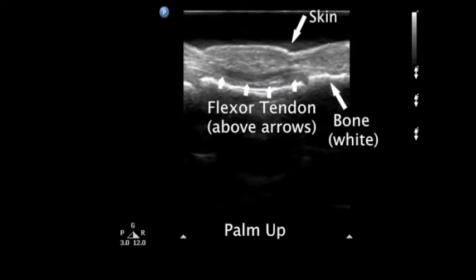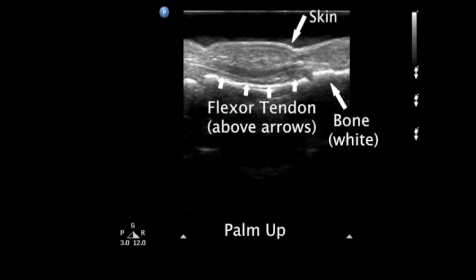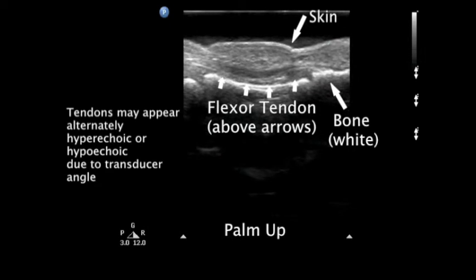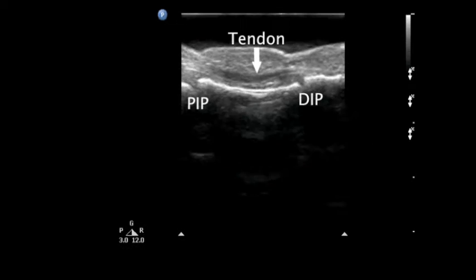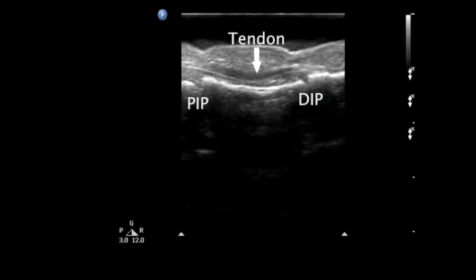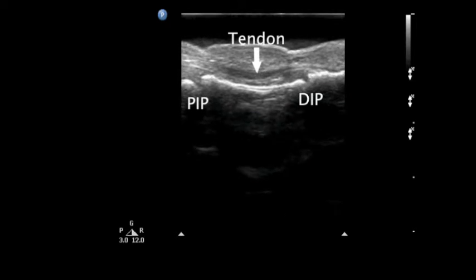Looking at the palmar aspect of the finger, the skin and subcutaneous tissue is seen at the top of the screen, and then the flexor tendon. Deep to the tendon are the palmar aspects of the bones and the DIP and PIP joints.